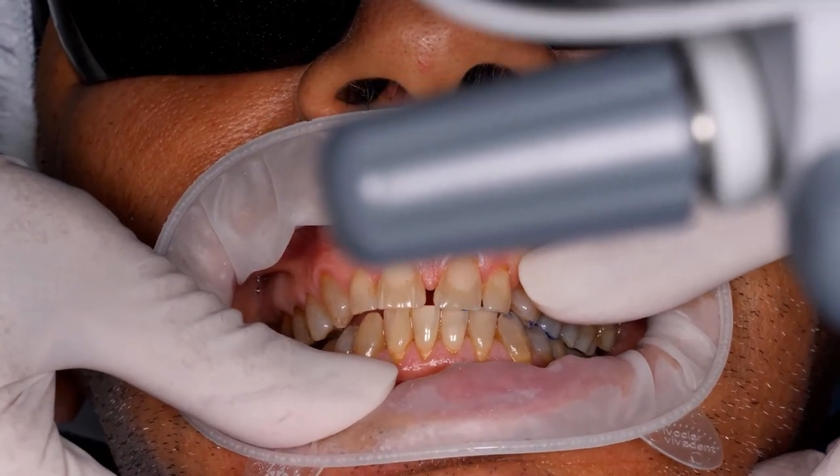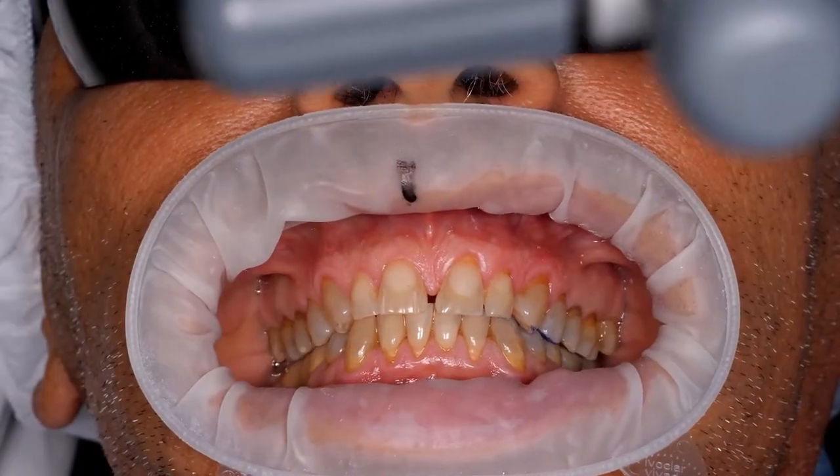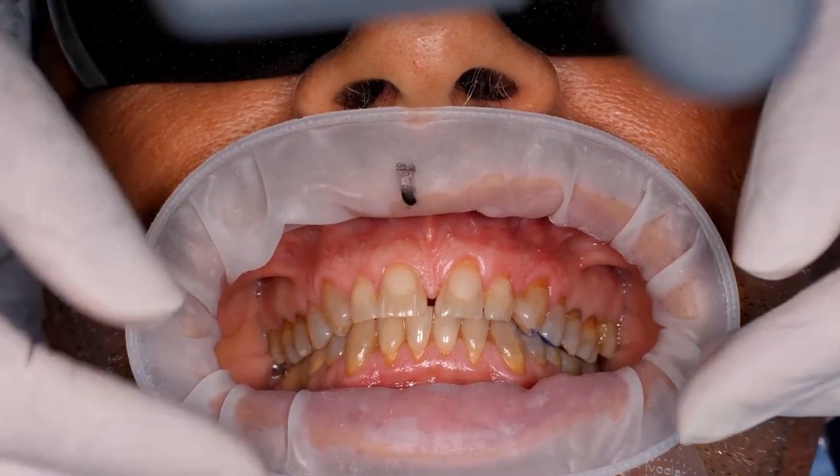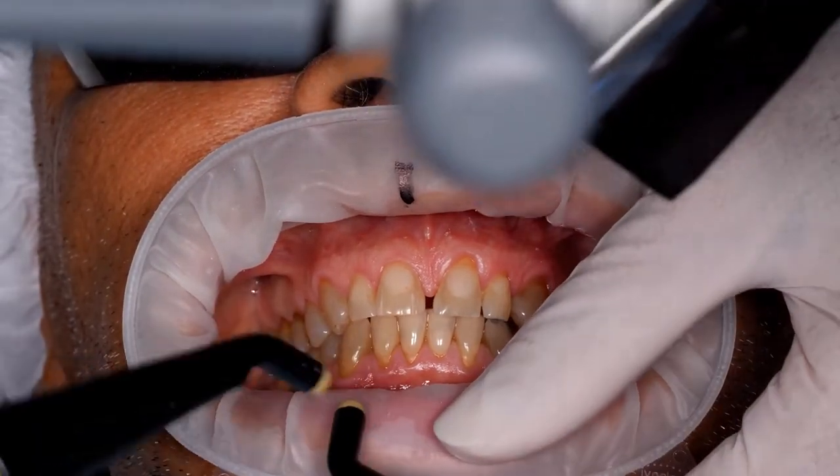On the other hand, the patient can easily move his jaw to the left. With a group function, possibly on the first left premolar. And we find this type of diclusion acceptable, so we won't change it. And we'll keep this guidance.